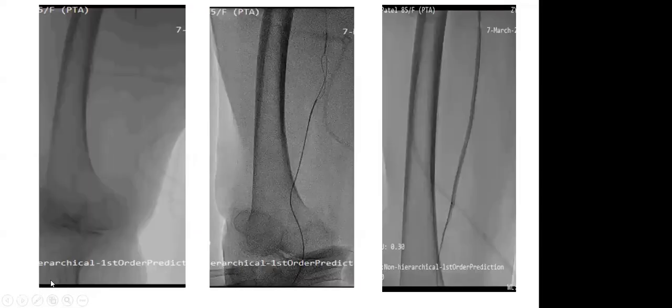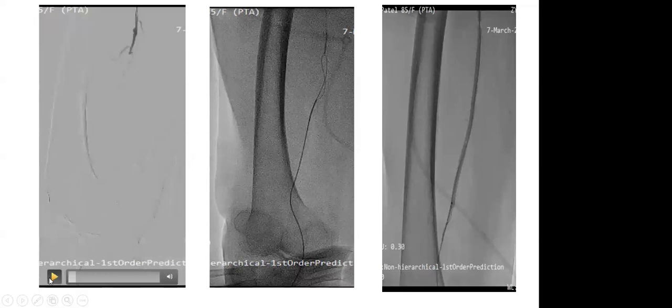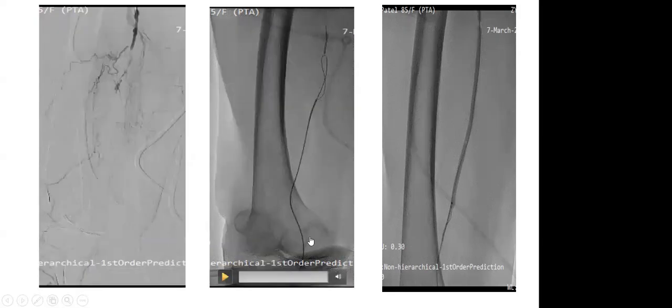We tried from the antegrade aspect, but we were not successful. Then we came from the retrograde aspect. Even though there was single vessel outflow, we were able to puncture the ATA because the ATA caliber was significantly larger. After that, we did the SAFARI technique as well after balloon, and then we were able to pass the wire.